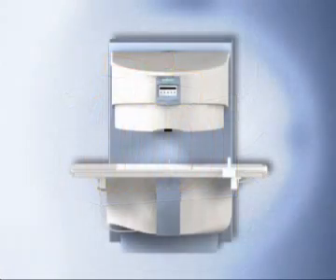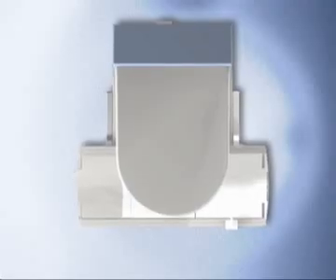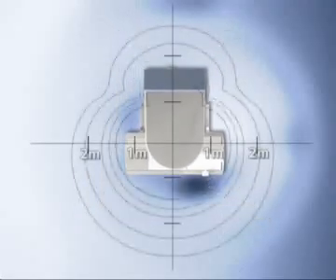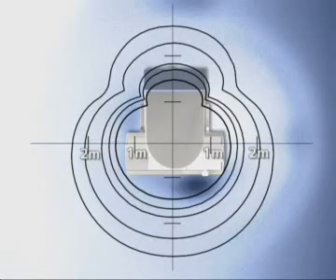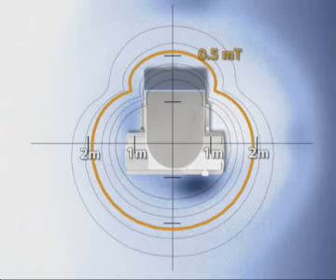For MR, the magnets are largely shielded so that their fields only act inwardly on the patient and quickly fade in an outward direction. This differs for various systems and depends on the field strength and design of the magnet. The use of magnetizable objects in the area of the fringe field is strictly prohibited, since the MR system exerts an attractive force on them.